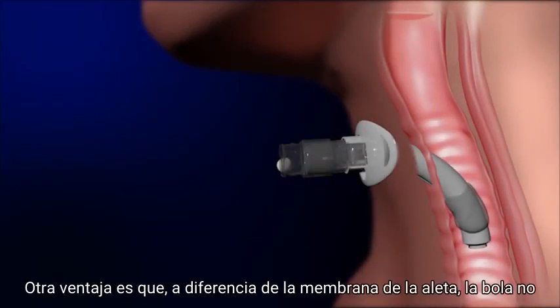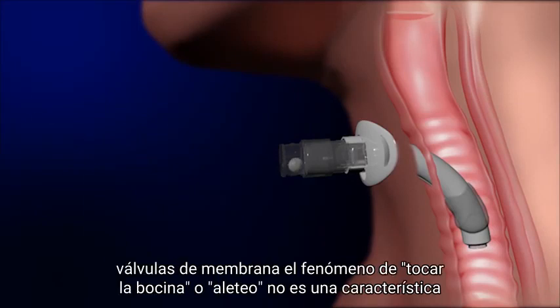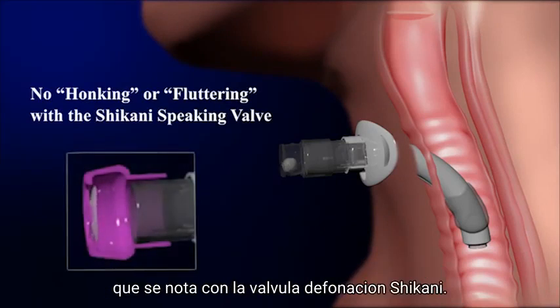Another advantage is that, contrary to the flapper membrane, the ball does not degrade over time with repetitive opening and closing. Hence, contrary to flapper valves, the phenomenon of voice honking or fluttering is not a feature that is noted with the Shikani speaking valve.